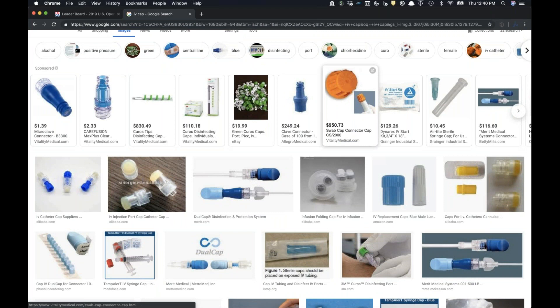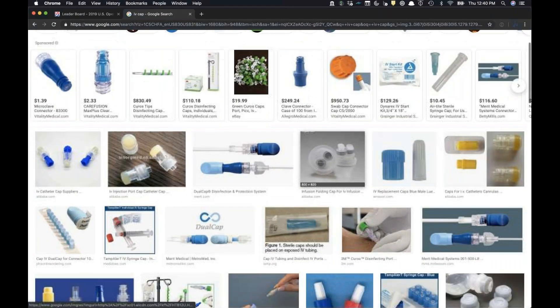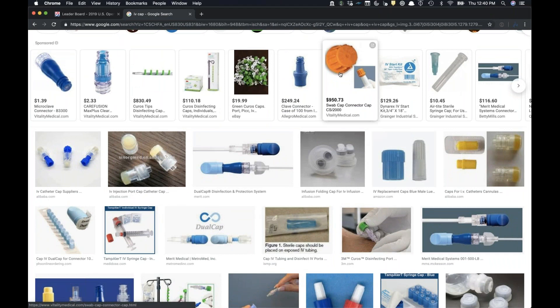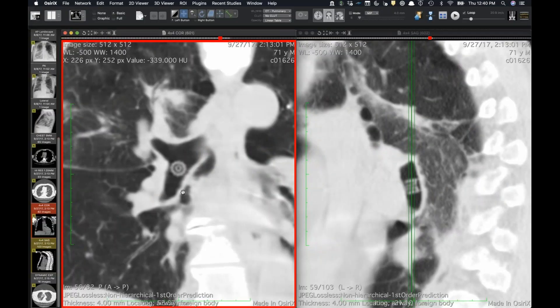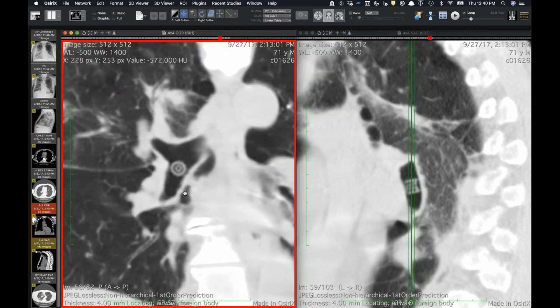He must have aspirated an IV cap during his hospitalization. You can see it looks kind of like a green or orange IV cap — you can even see the little spokes on it. So clearly he was aspirating, which caused the pneumonia in the first place, and then he had a repeat aspiration of something while he was in the hospital. They removed it bronchoscopically.